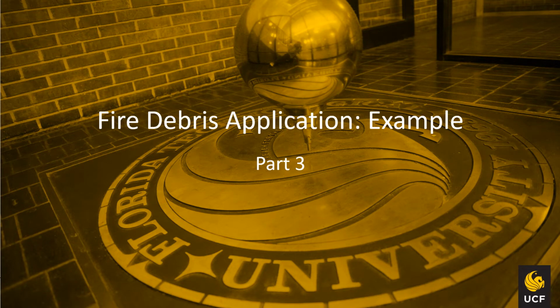Hello, and welcome to the third video on the novel fire debris application called Fire Debris Application Example. My name is Michelle Corbally, and I will be narrating this video. This presentation will show an example of running a fire debris sample using the novel fire debris application.